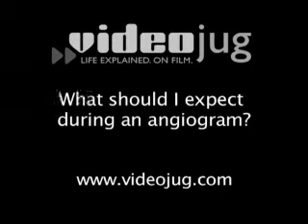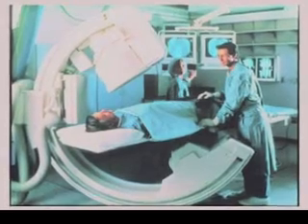What should I expect during an angiogram? What you can expect when you have an angiogram is that you will be brought into a special room called an angiography suite. You'll be placed on a table where you'll be prepared by cleaning off and potentially shaving a portion of your body in order to allow safe entry of the catheter into the body. Once that area is cleaned and you're covered up by sterile drapes used for a surgical procedure, then you will have some local anesthetic placed in the area where the catheter will be inserted.